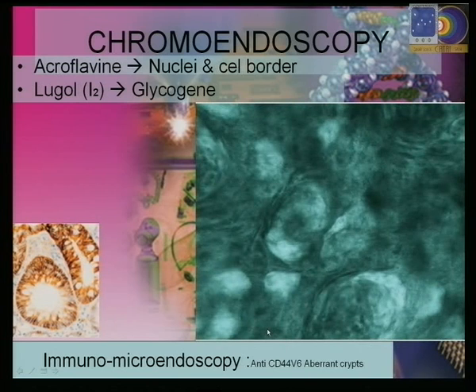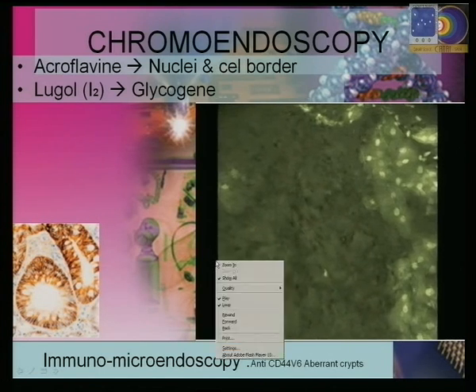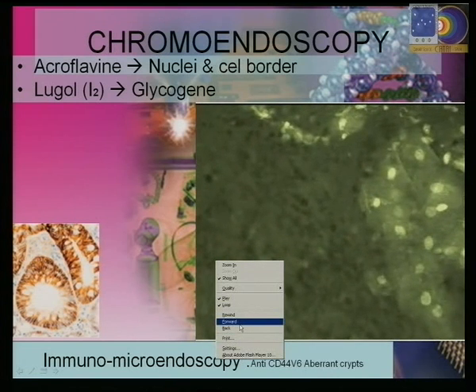Here, the tumor vessel seen after the application of fluorescein is further magnified and colorized. Malignant, irregular and dark changes are seen in contrast to bright normal cell architecture of squamous epithelium after local acroflavin application. In the magnified mode, single cells with normal nuclei are marked with an arrow at the right. The malignant changes are highlighted with a second arrow at the left. Endomicroscopic guided biopsies revealed a poorly differentiated squamous cell cancer.